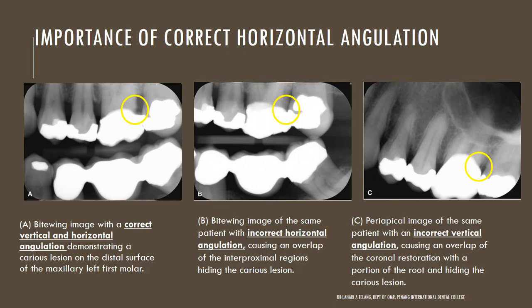The importance of correct horizontal angulation: a bitwing taken with the correct horizontal and vertical angulation demonstrates a caries lesion on the distal surface of the maxillary left first molar, as circled in image A. The same area in image B has the caries obscured due to incorrect horizontal angulation and overlapping of the proximal surfaces. In image C, a vertical periapical view of the same area, the proximal caries is also obscured due to incorrect vertical angulation. If a lesion is missed yet suspected clinically, another image should be taken to rule out the presence of caries.